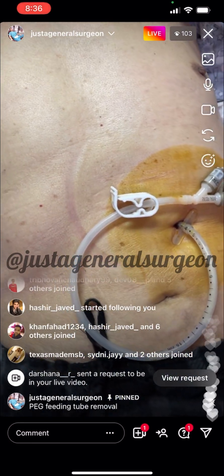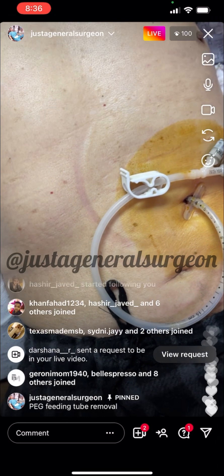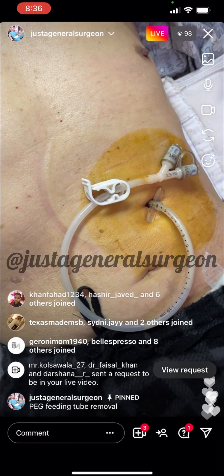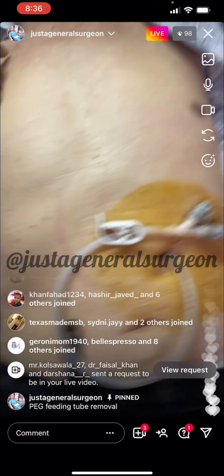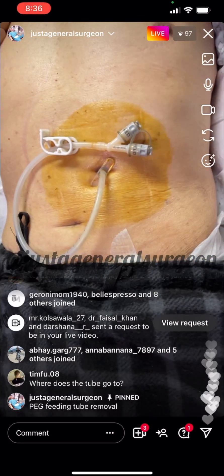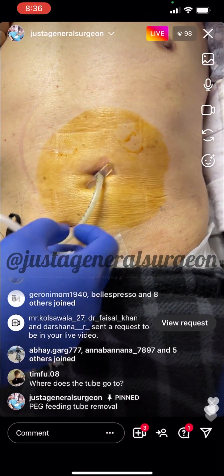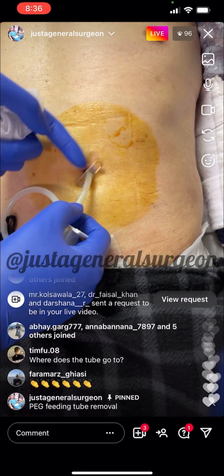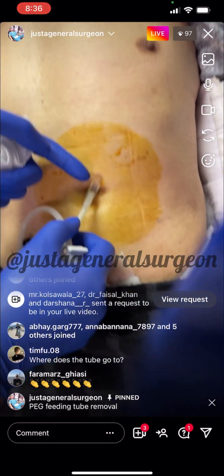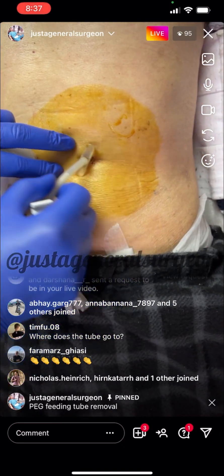He's going to have a gastrocutaneous fistula, which will heal on its own — we'll show you that in just a second. Does anyone have any questions before I proceed? I'm going to hand my phone to the assistant. We have consent from everybody. Our patient is laying down on the table, nice and relaxed. Everything has been removed — there's no tape or sutures securing the tube to the skin, so we're ready to go.